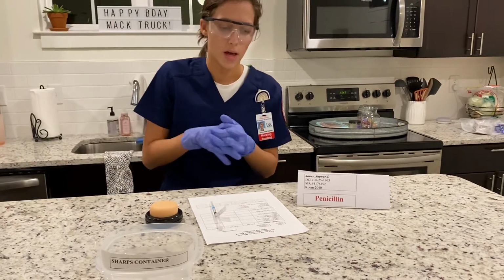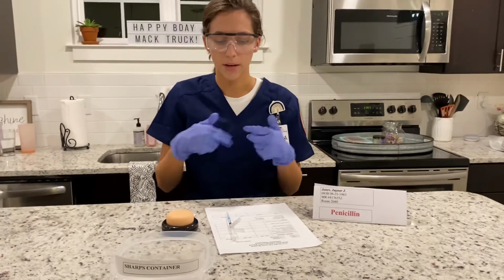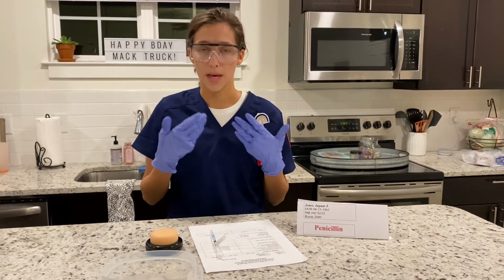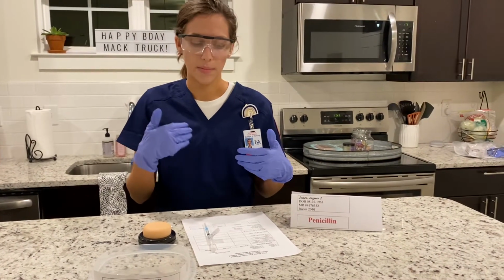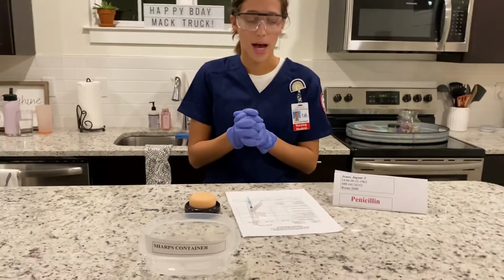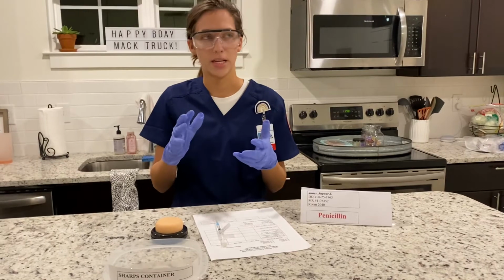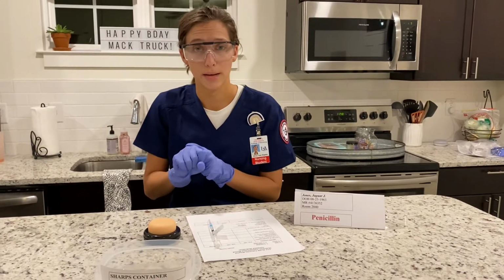This is going to be on the abdominal area, and I'm going to stay clear of the 2-inch border around the umbilicus, and I'm going to make sure I don't go below the pubic area or above the intercostal margin, and I don't want to go past the anterior superior iliac spine. Now I am going to be checking the skin for any skin integrity issues, as well as any bruising.